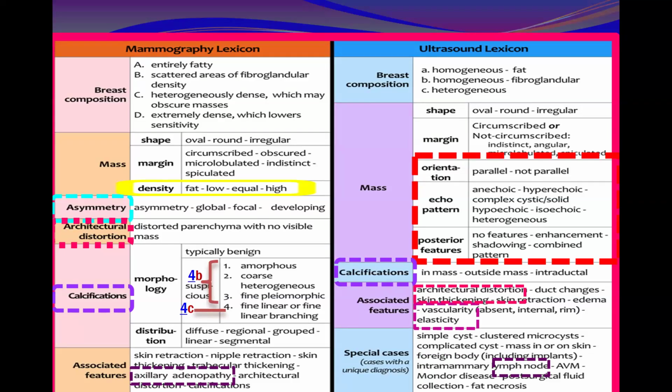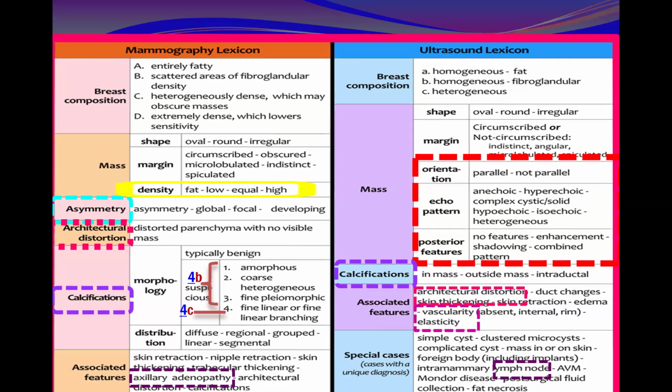There are also more descriptors in associated features that belong to the ultrasound lexicon and are not included in the mammography lexicon, which are Doppler vascularity and elastography.